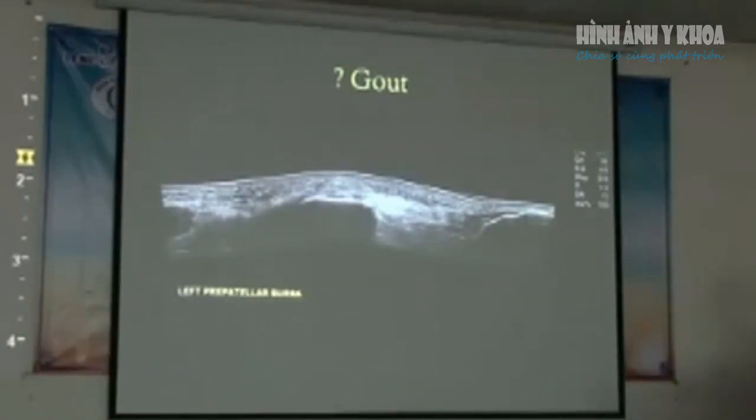But as you can see, there's quite a bit of edema within the prepatellar bursa, but there's no discrete fluid collections there.